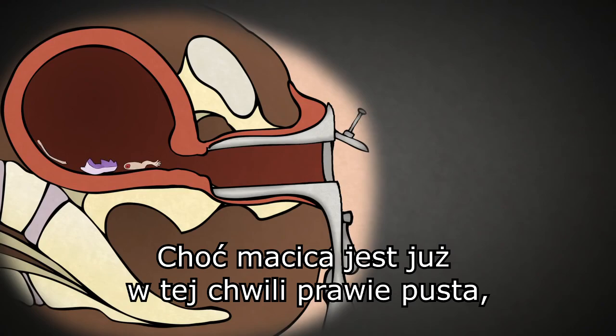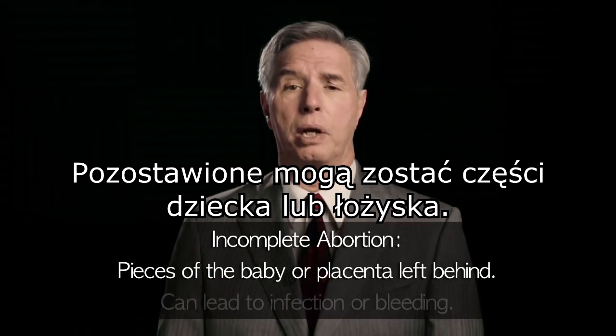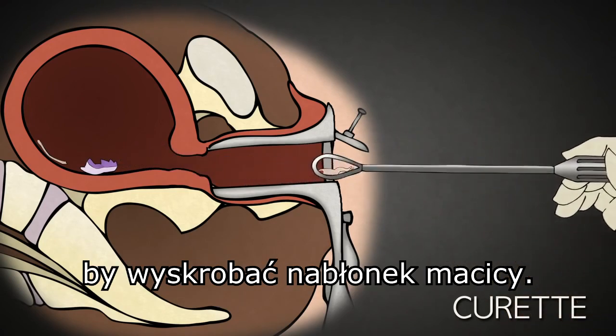Though the uterus is mostly emptied at this point, one of the risks of a suction D&C is incomplete abortion — essentially, pieces of the baby or placenta left behind. This can lead to infection or bleeding. In an attempt to prevent this, the abortionist uses a curette to scrape the lining of the uterus.